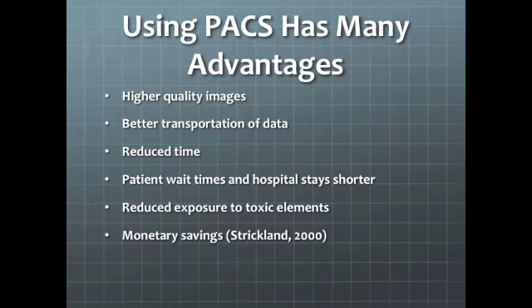PACS has many advantages. Radiologists have access to higher quality digital images to interpret and perform comparisons. The amount of time to receive the images is reduced, allowing for faster interpretation. Better transportation of data to physicians allows physicians to obtain reports quickly from radiologists, which will improve continuity of care. Better communication will reduce potential litigation due to loss of film and patient history. Time will be reduced for staff that work in the film library and the film room because of the upgrade from the film-based to digital-based systems.